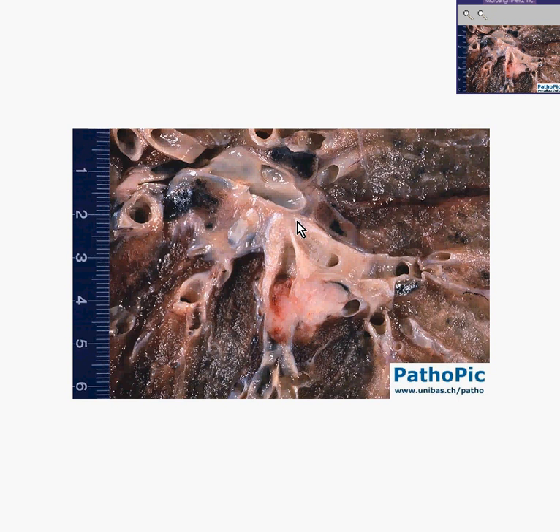Classically, they start in the areas of the lung which have squamous cells or squamous metaplasia, which is usually the large bronchi. You can see a large bronchus here, and it is obstructed by a tumor that shows infiltration into the surrounding tissues.